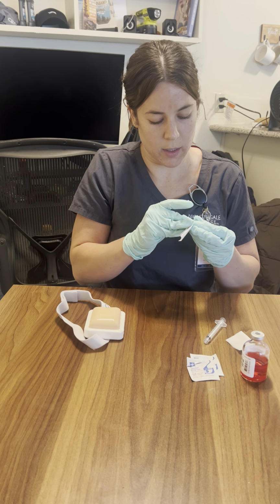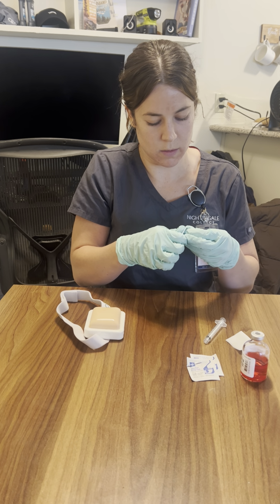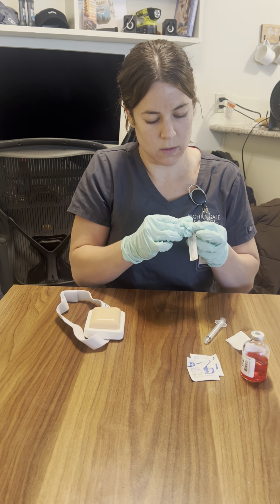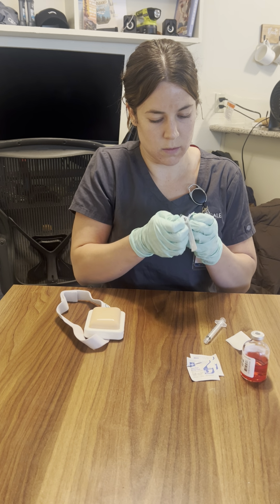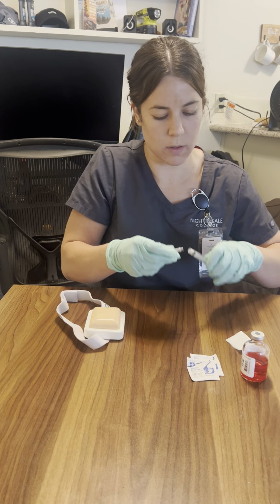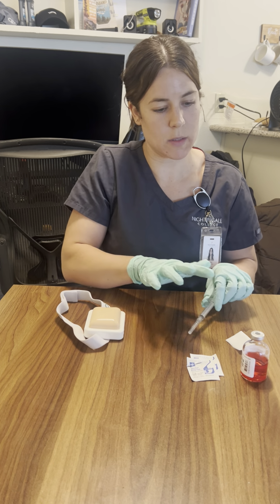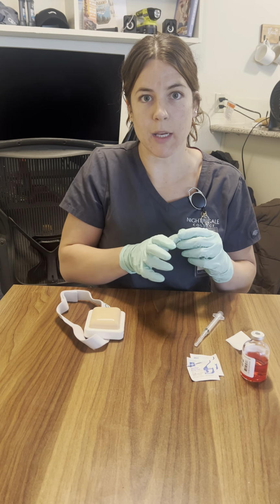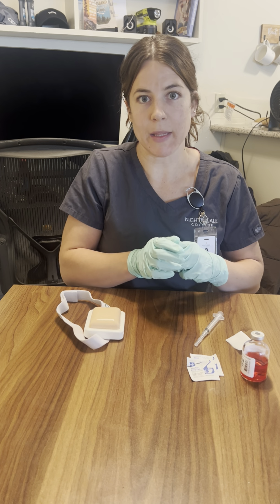So I'm going to go ahead and get that opened. Get it assembled. And then I just want to make sure that I have the morphine as prescribed. It's going to be 4 milligrams per 1 milliliter. I'm going to need to do 1.5 milliliters for my injection.